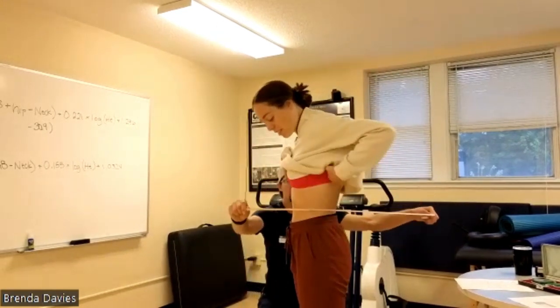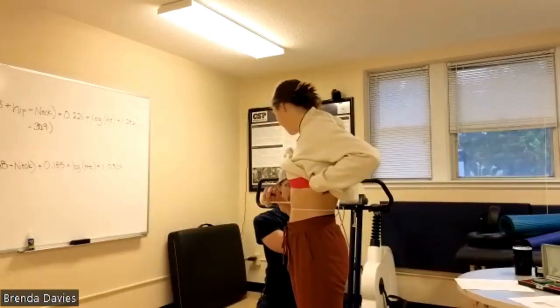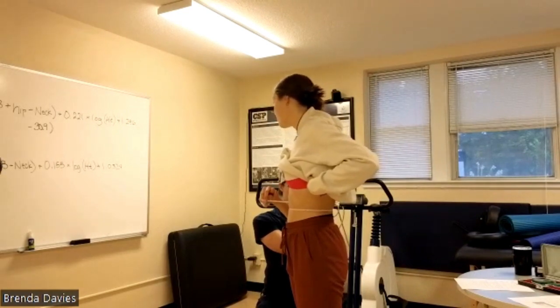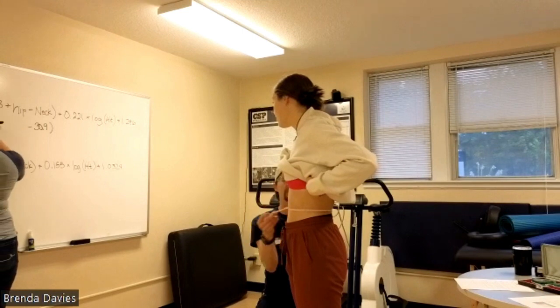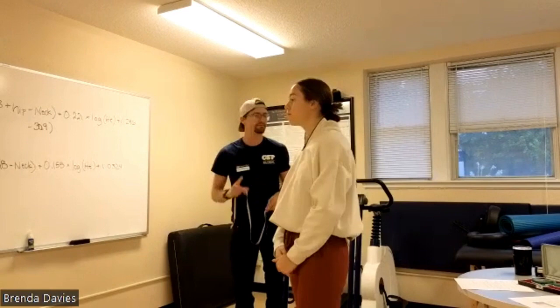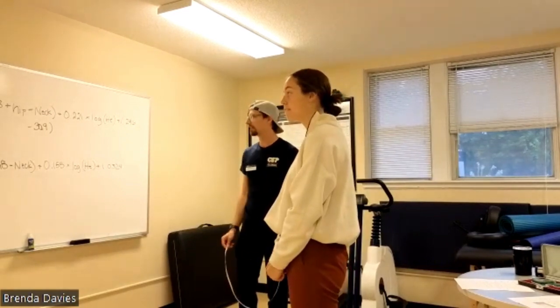So you can see it doesn't always go as planned. So again, you don't want to pull too much, but you're at 66.5. We're just doing one today, but typically you would do 3 and average it out.